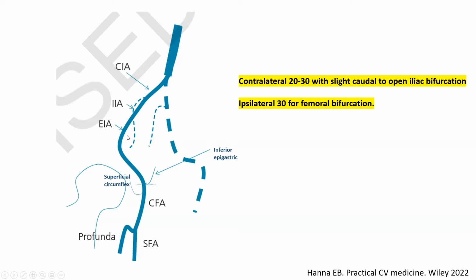Another thing on this image, a general idea that I hope you already know: notice how the common femoral at the level of the inguinal ligament and that inferior epigastric loop dives deep in the pelvis. This is when we call it external iliac. And that's why sticking the external iliac is so risky, because you're deep in the loose pelvis with no bone support. That's why a stick here has a high risk of bleed, RP bleed.